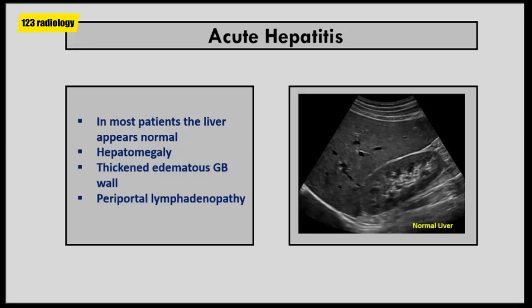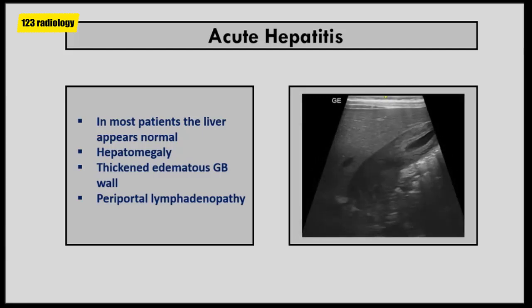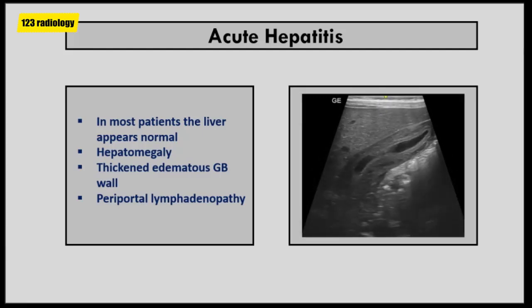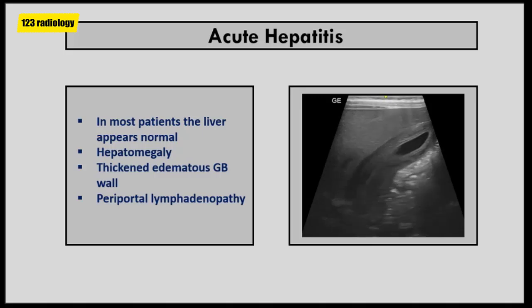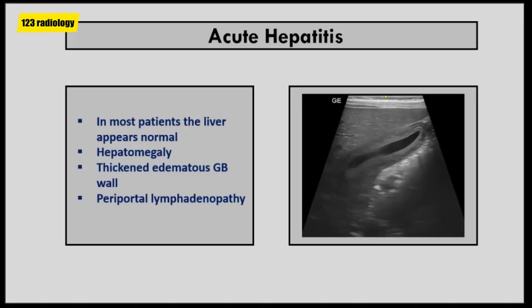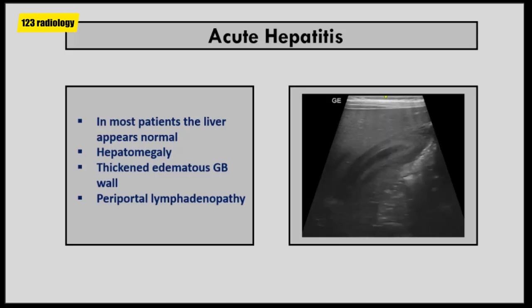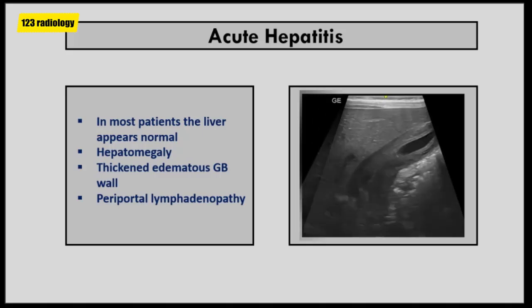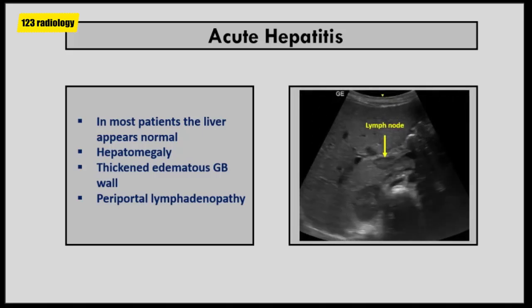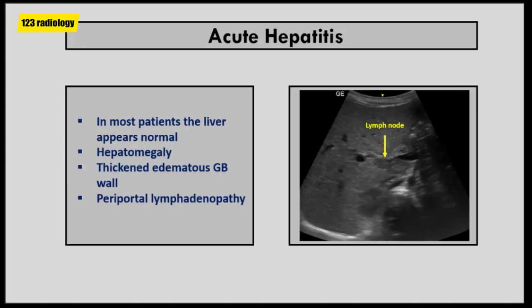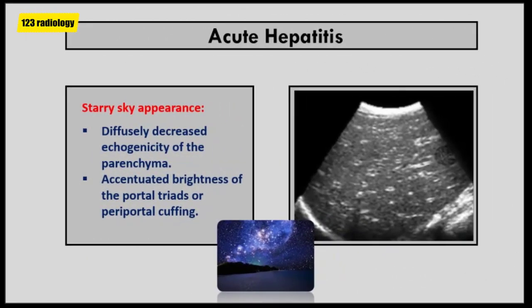Hepatomegaly is seen in many cases. Thickening of the gallbladder wall occurs in up to 80% of acute hepatitis, particularly in viral hepatitis, as you can see in this case. It occurs due to hypoalbuminemia that generates gallbladder wall edema. Periportal lymphadenopathy can be seen in patients with acute hepatitis, particularly in viral hepatitis. The liver parenchyma may show diffuse hypoechogenicity, with accentuated brightness of the portal triads, or periportal cuffing.